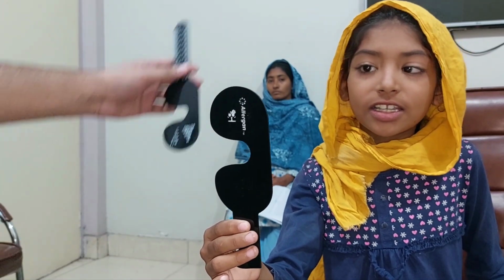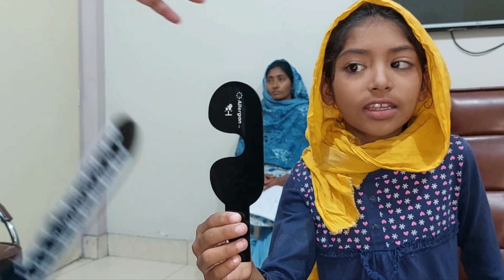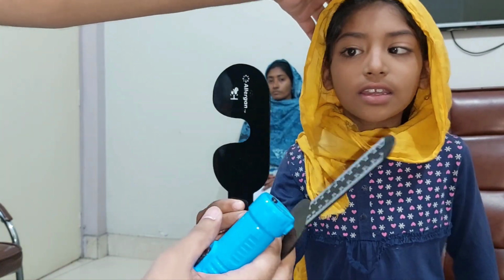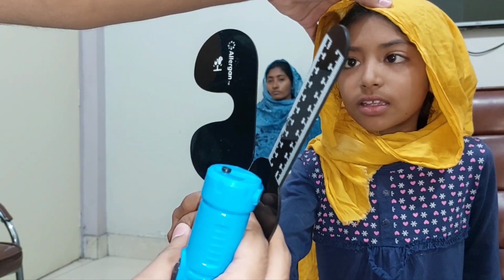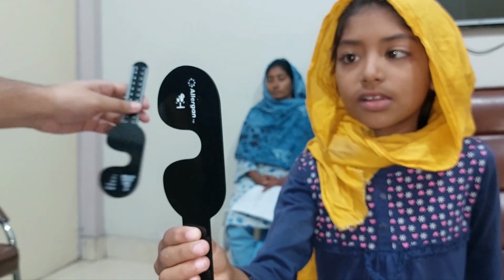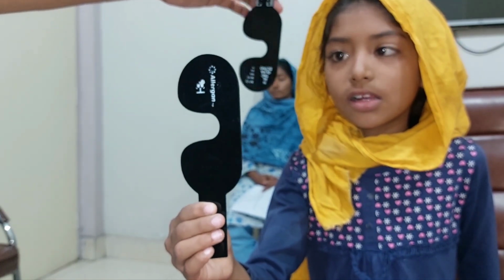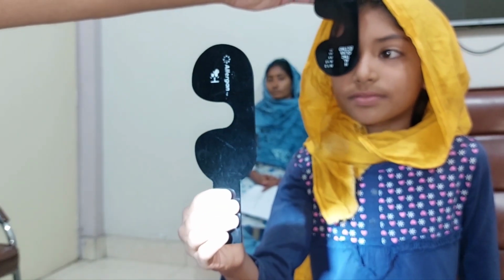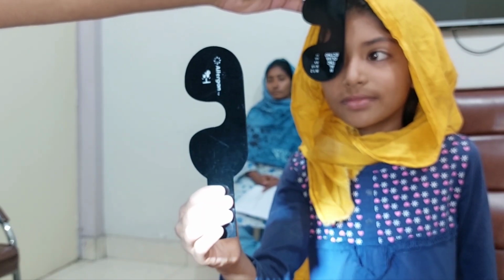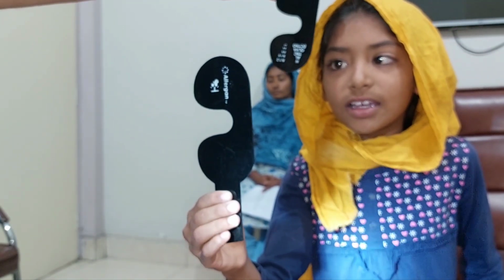Okay. Patient is accommodating. Keep the head straight, in the primary position. Now covering the fixating eye, which is the right eye, the cover test of the left eye and the uncover test of the right eye.